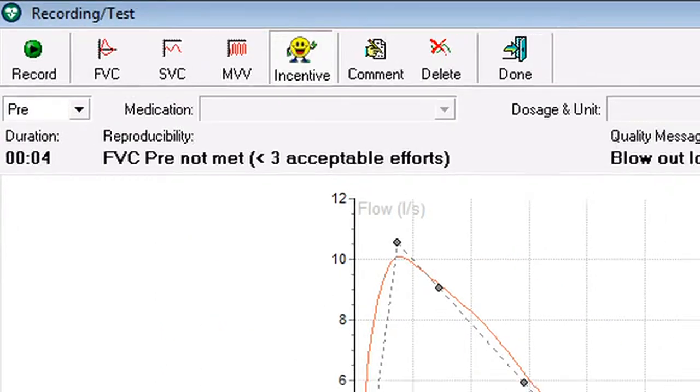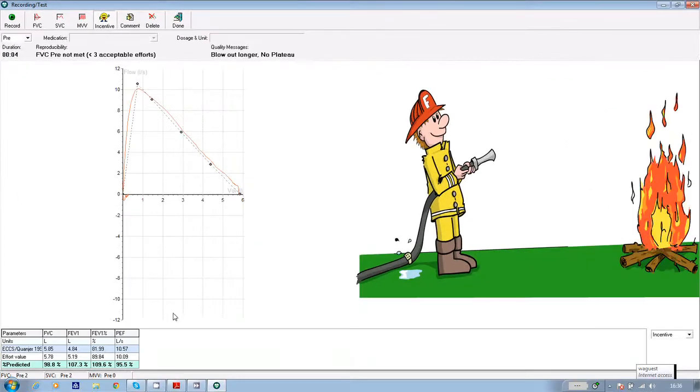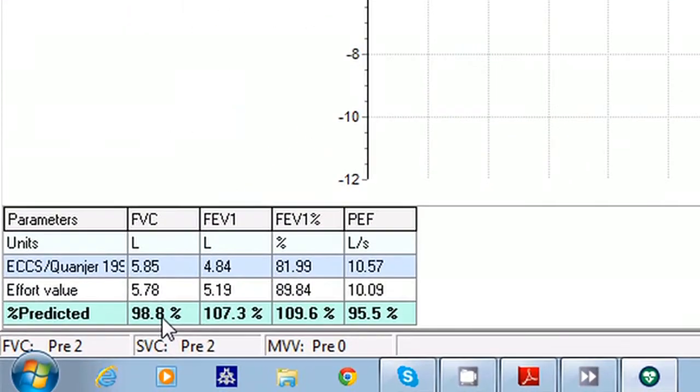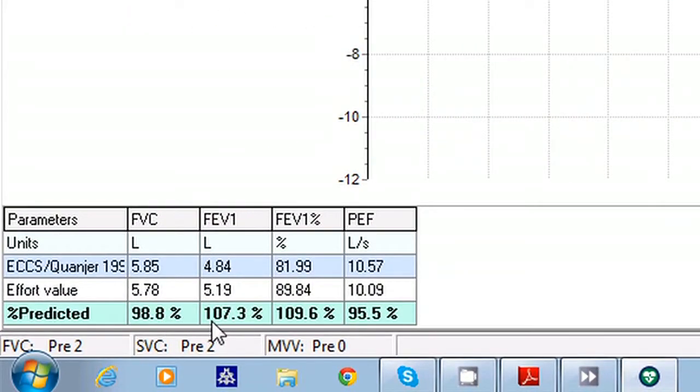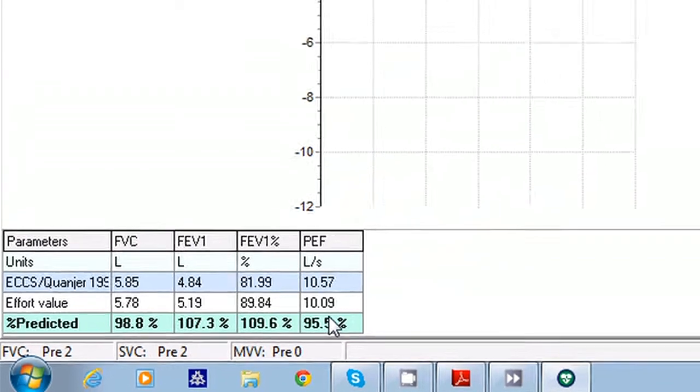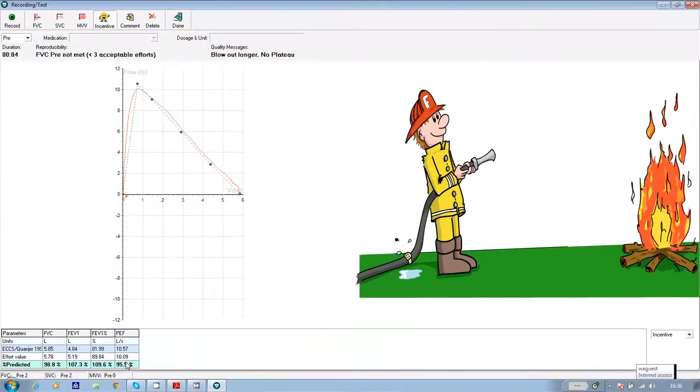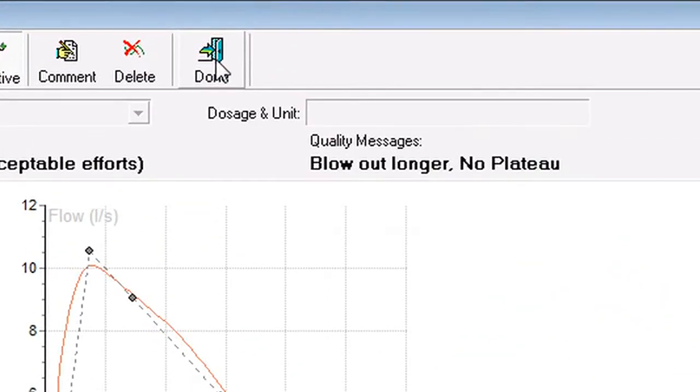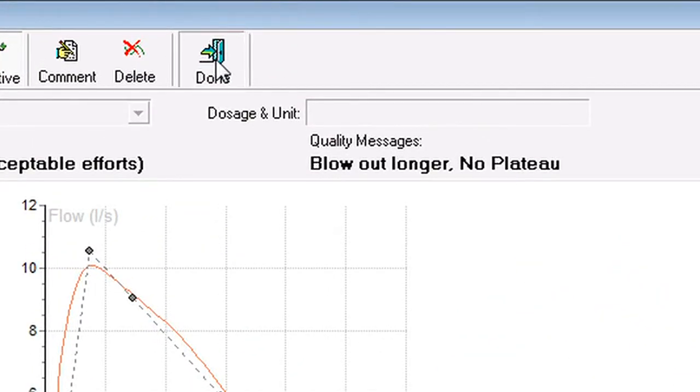Once again, the actual effort is logged and compared to the predicted norm and you get a percentage against predicted at the bottom of the screen. When you've finished the FVC part of the test, click on done.